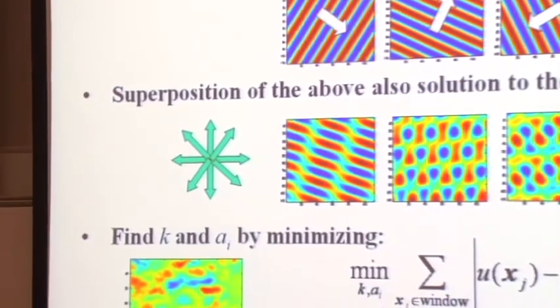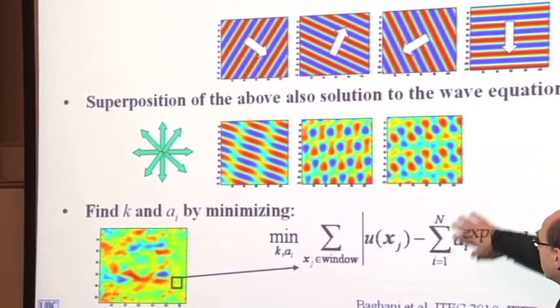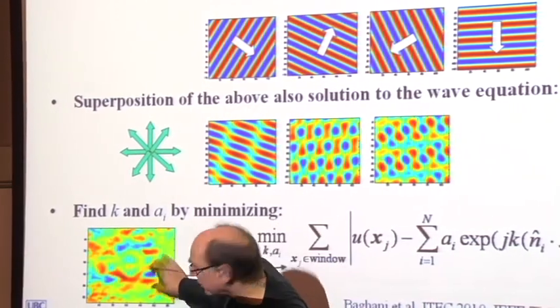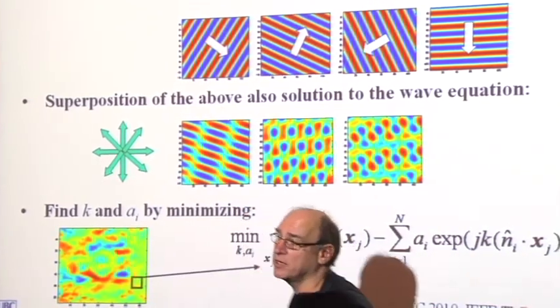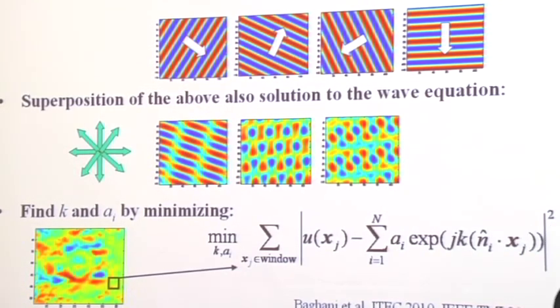Okay, so when you look at the traveling wave expansion, for example, in MR, this is over a volume. You look at the XYZ component of the wave. We're looking at the displacement, and then we're looking at what's the traveling wave expansion over the same region. Then we shift the region, repeat the whole thing again. Shift the region, repeat the whole thing again. This is very high level. We have a TMI paper coming out.